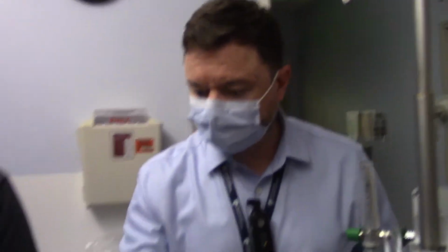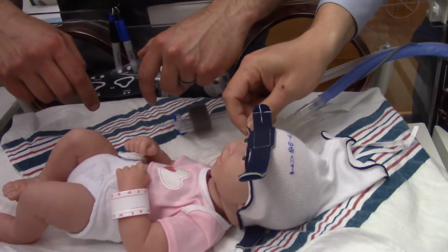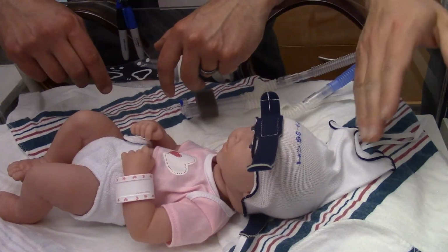With the mask, you're going to see it around the bridge of the nose, possibly underneath the nose, possibly pulling up, and you'll start to get at the bottom of the septum some breakdown there. And then also if we're using the prongs, you'll start to see prong breakdown on the nasal septum. So I would just say make sure that the interface itself looks good. If the hat gets too stretched out, that's another thing that I've seen often. If the hat is too loose, it can also make the interface just kind of flop around and you're not going to get a good seal with that.